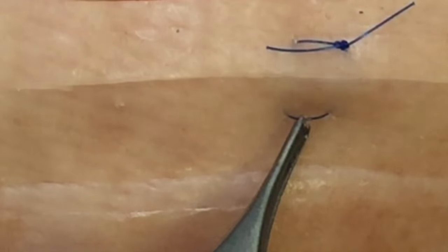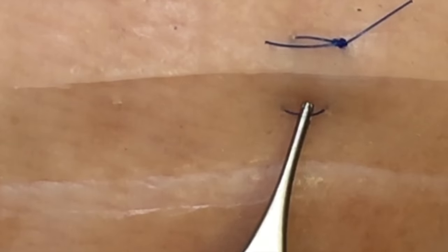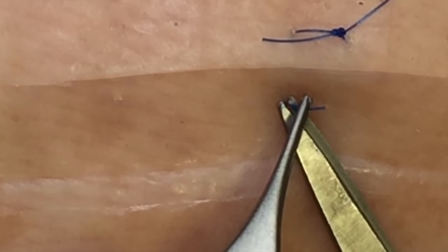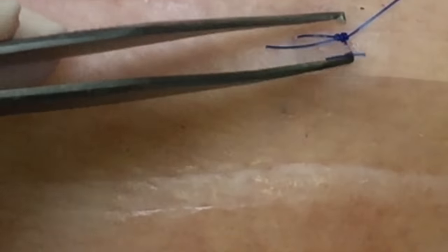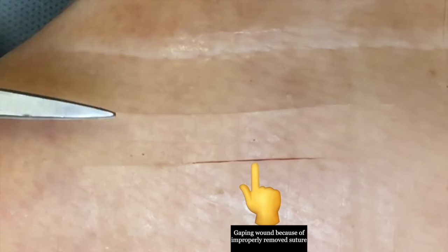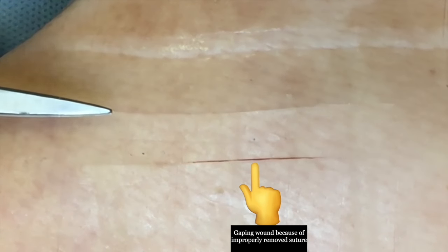Similarly, on the horizontal suture, place your forceps underneath, cut the suture flush with the skin and remove that across the wound as shown here. By removing the suture as shown, you reduce the risk of both contaminating the wound and of opening the wound up or causing it to dehisce.